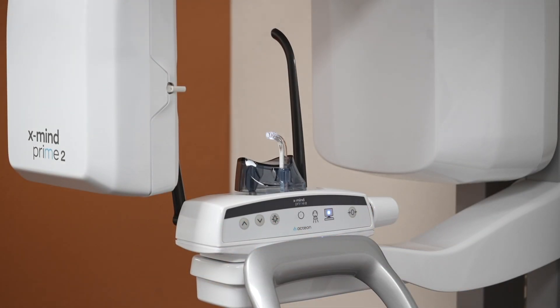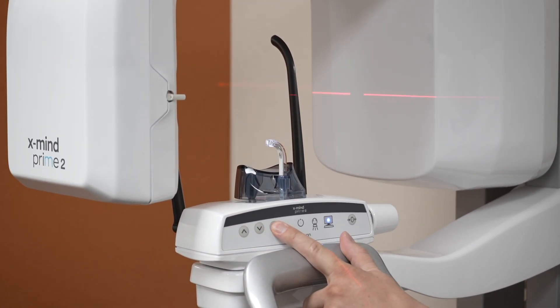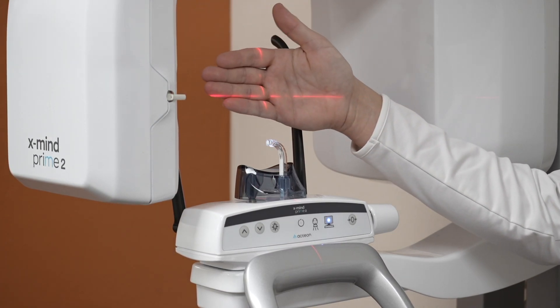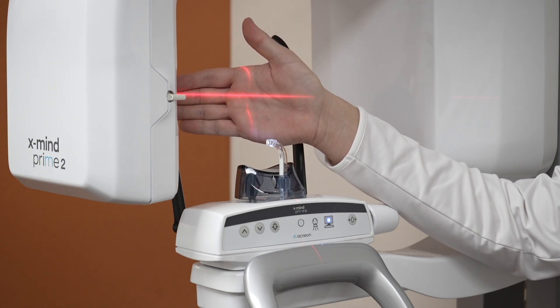First we have some buttons here on the main arm: the up, the down, and the third one which turns on the laser lights. These laser lights are very useful for positioning — you have one that goes right up and down the midline and one that's horizontal for our Frankfurt horizontal, to line up with our ala tragus line.